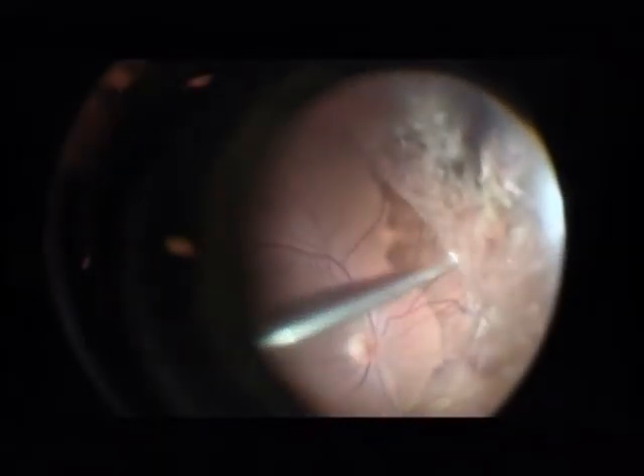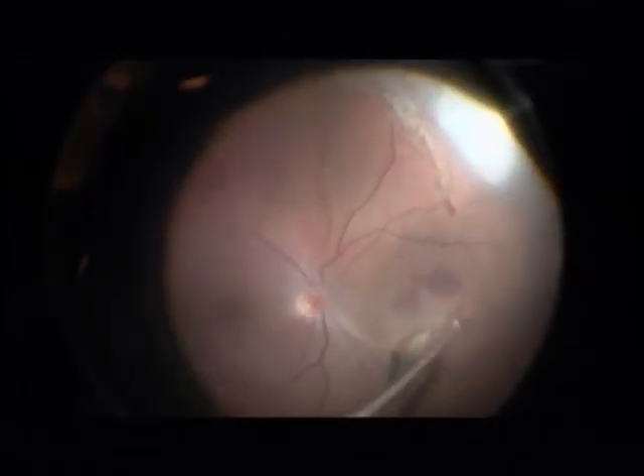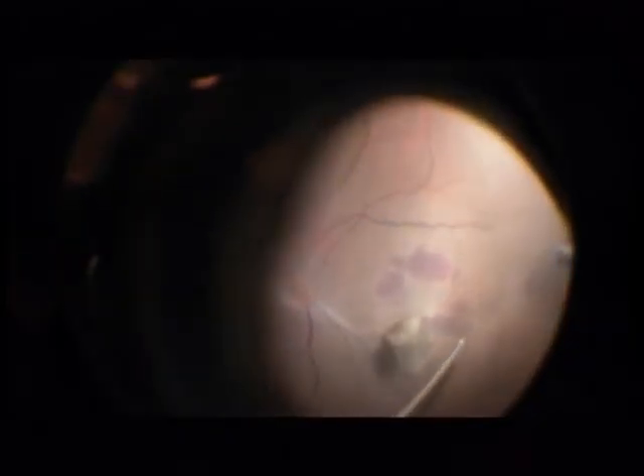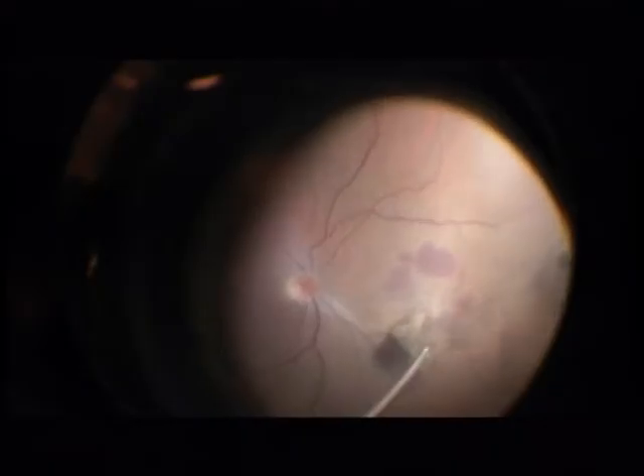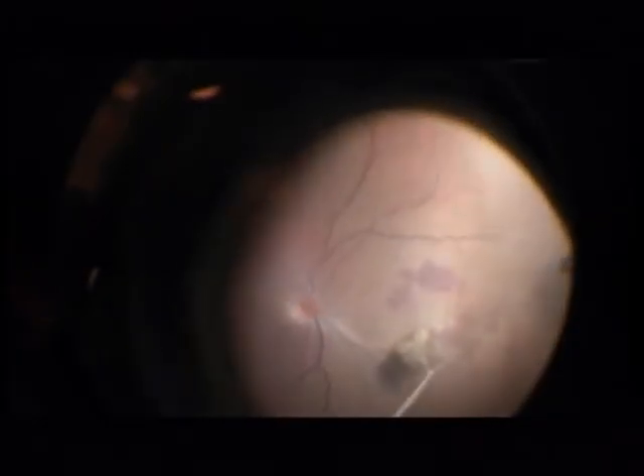Here is the metal foreign body at the nasal pole. Please note also the residual subretinal choroidal hemorrhage. Here is still some attached posterior hyaloid which I am trying to remove. This is a 25 gauge vitreous cutter.